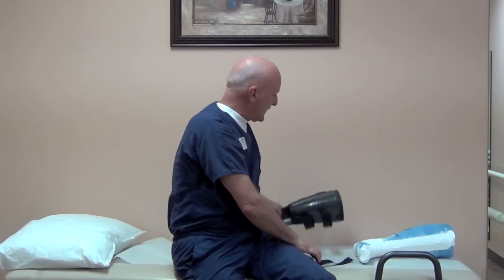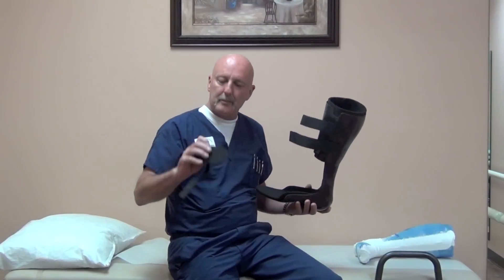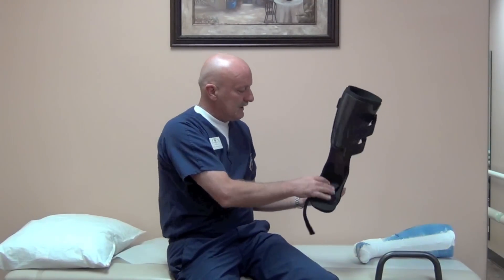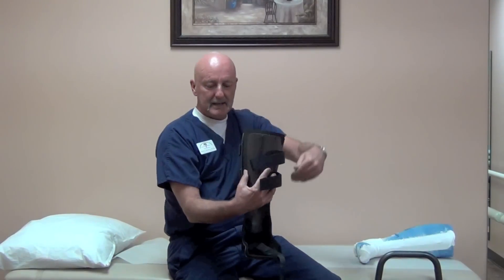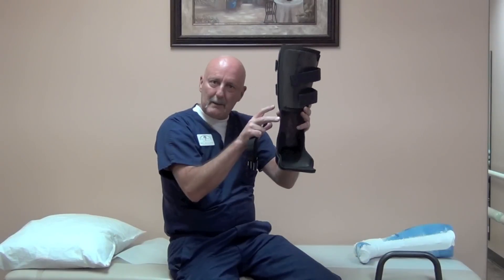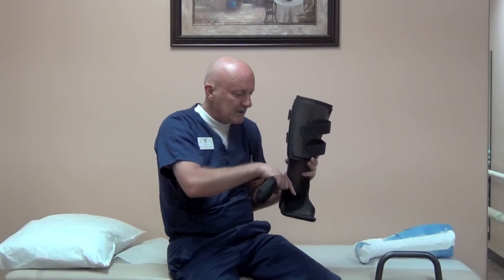Once we do that, when the patient puts the brace on, they incorporate a half or five-eighths inch wedge, put that inside the AFO with the little tab going out front. They strap the brace on their leg, then pull this out and the leg will drop down — but it will drop down just far enough where the heel will barely touch or not touch at all.